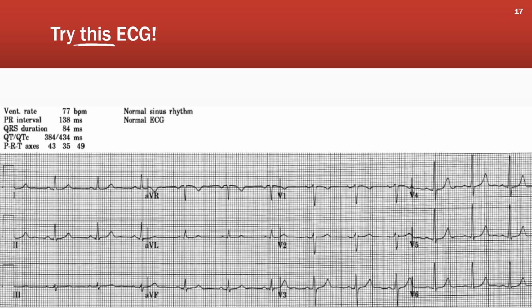Well, that seemed to go well, so let's try this ECG, and I will help you with this one. Locate the most isoelectric or equiphasic lead in the frontal plane. I'll give you a moment. It's lead 3. Lead 3 has the most isoelectric or equiphasic appearing QRS complex.